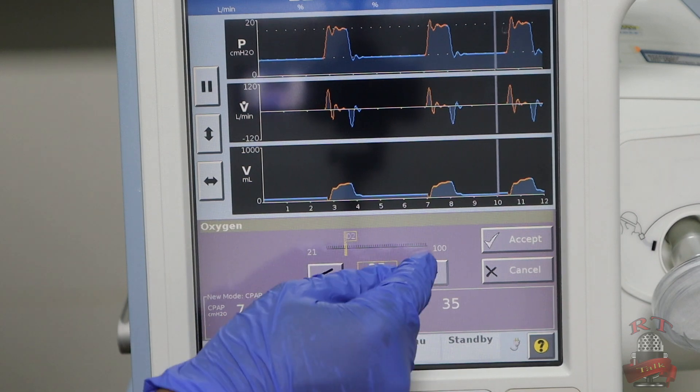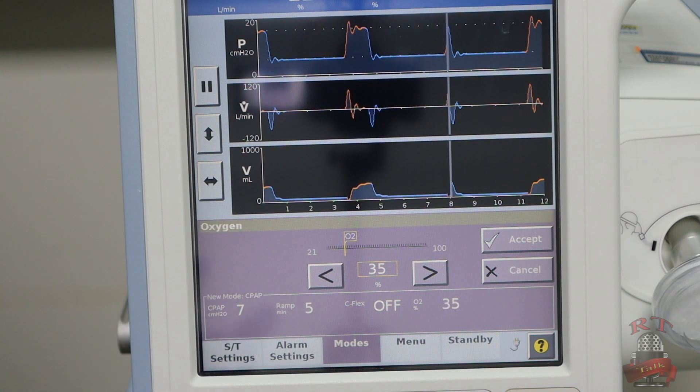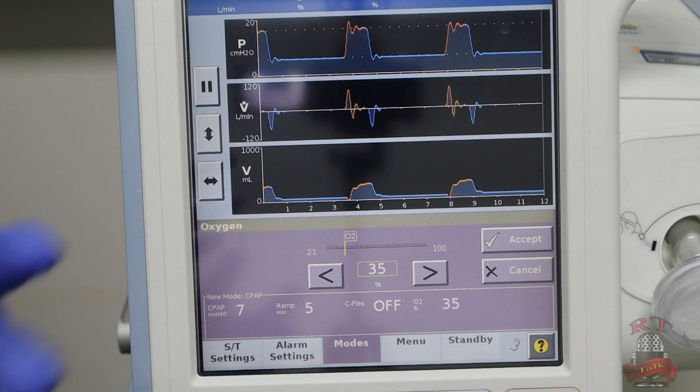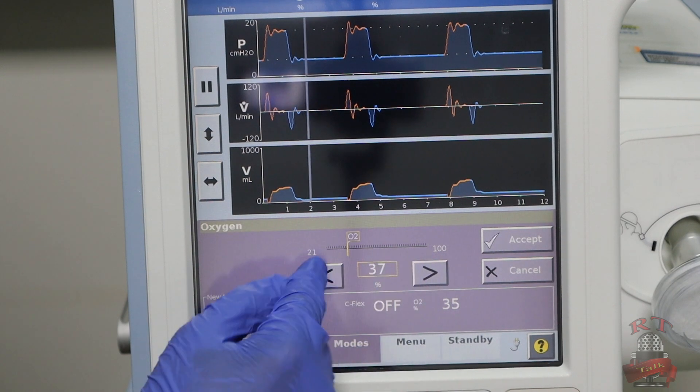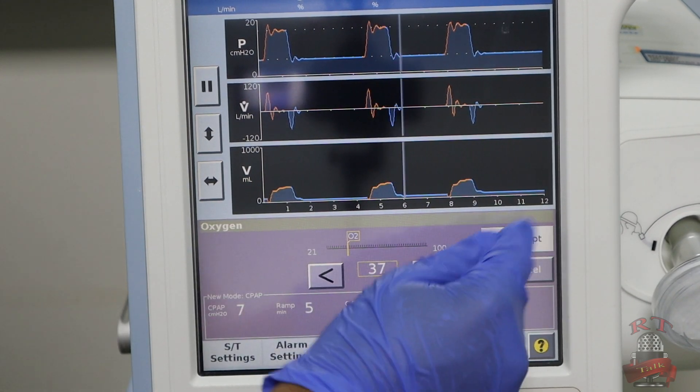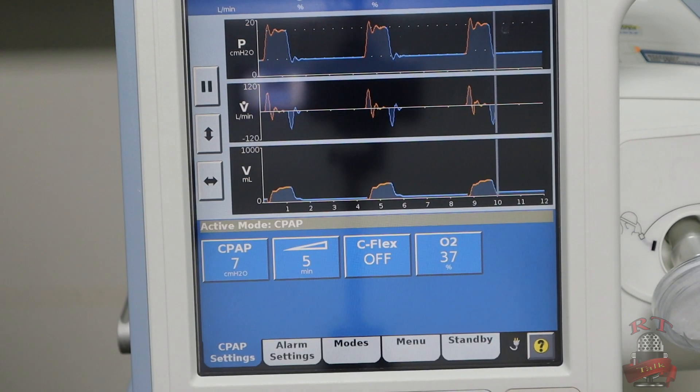The last thing is the percentage of oxygen you want. We always want to keep our saturation more than 92. So you will ask your doctor what saturation level is needed for your patient, and you will adjust your percentage of oxygen accordingly. After that, you will activate CPAP mode. So now you are ready on CPAP mode.